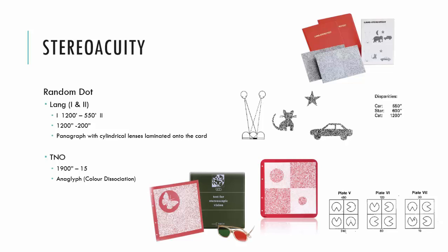And specifically here we're talking about patients with a microtropia. A patient with a microtropia who may actually have some level of stereoacuity will or should fail a random dot stereoacuity test. So it is actually a good test to assist you in confirming the diagnosis of a microtropia.